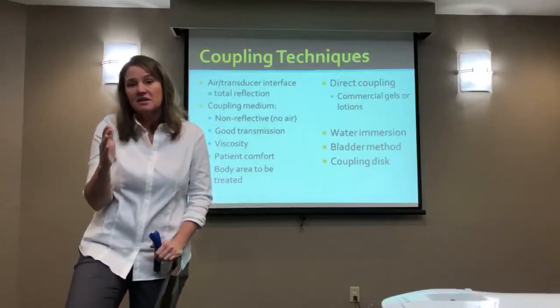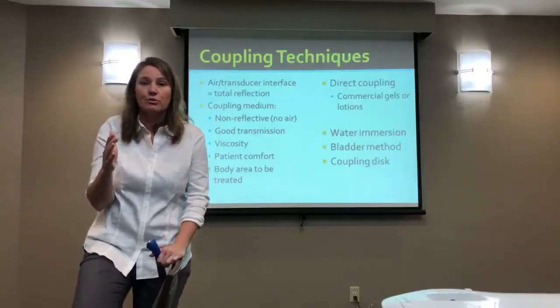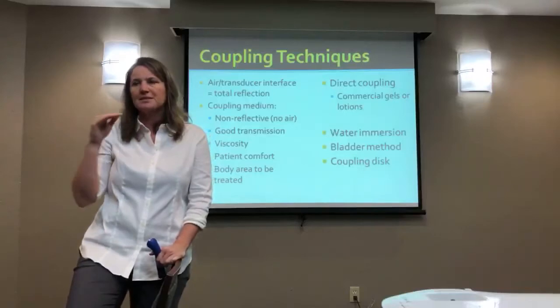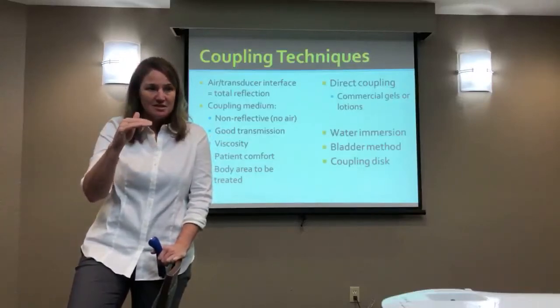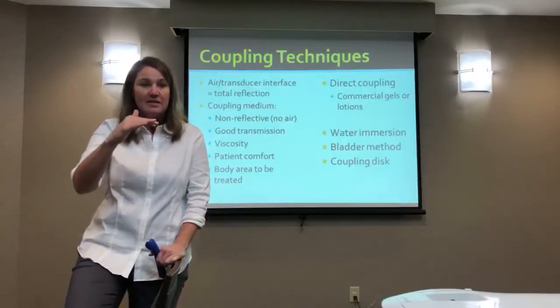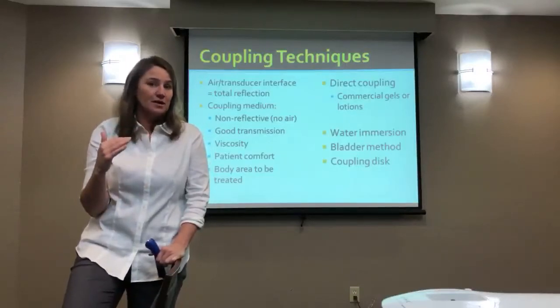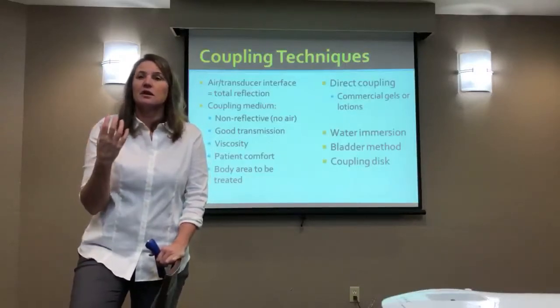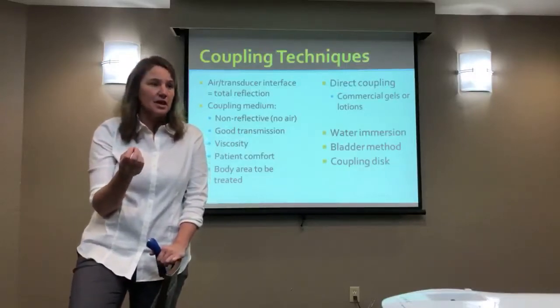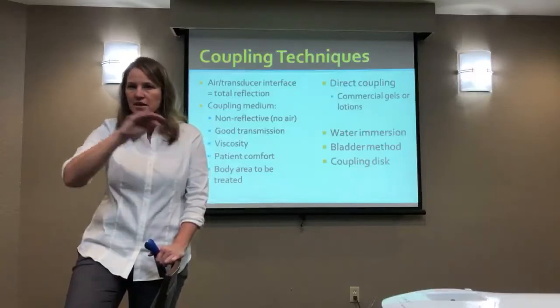It makes sense. Seems to me like a lot to go through. And even trying to accommodate for the uneven surfaces, the possibility of entering air into the system seems likely. Trapping air under one side of the baggie or in the baggie seems like a very real possibility. But using some sort of a bladder as a spacer is certainly a possibility, if you take water in some way.